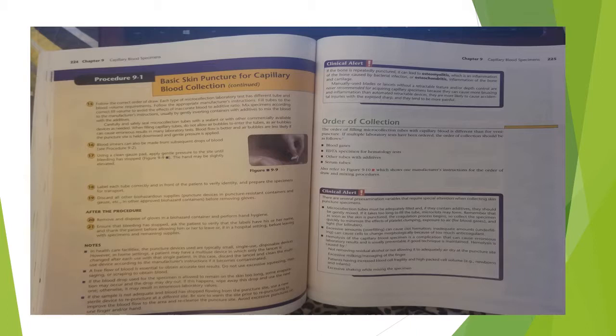A free flow of blood is essential to obtain accurate test results. Do not use excessive squeezing, massaging, or scraping to obtain blood. If the blood drop used for a specimen is allowed to remain on the skin too long, some evaporation may occur and the drop may dry out. If this happens, wipe away the drop and use the next one. Otherwise, it may result in erroneous laboratory values.